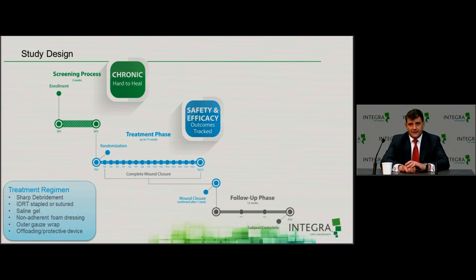2007, I'd done a small study of using IDRT on diabetic foot wounds. And besides, I was doing this back in 2007. Why are you guys so fancy? And I said, I'll show you the pictures to prove it. So I opened up my phone, and they weren't there, so I opened up my computer and took out the pictures, and sure enough, I had stapled the IDRT into all 10 patients' feet. So I was like, okay, well, I guess we're all fools.